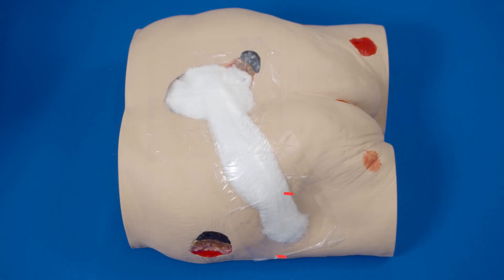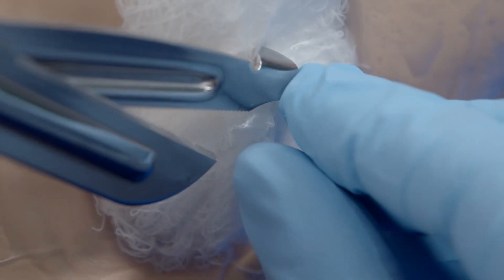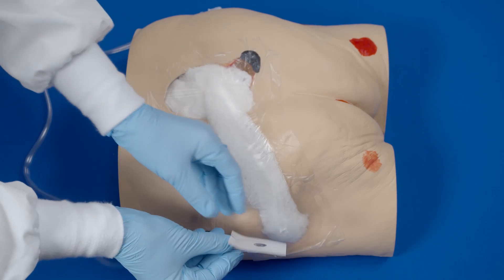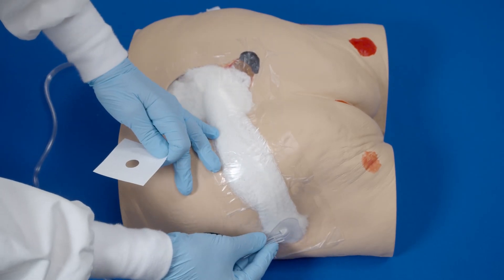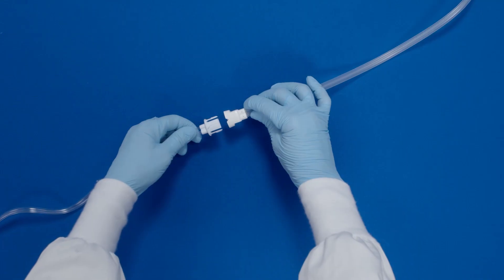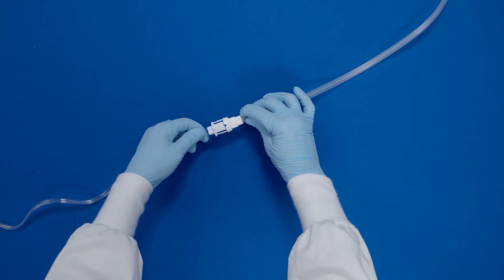Place the fit pad on the gauze at an appropriate location. Pinch the film, lifting slightly, and cut a small hole approximately one centimeter in diameter. Peel off the backing of the fit pad to expose the adhesive, then place the fit pad centered over the previously cut hole and press firmly for adherence. Attach the dressing tubing to the pump tubing by pushing the quick connector together until you hear a secure click.